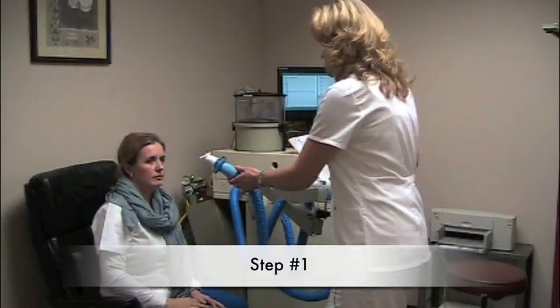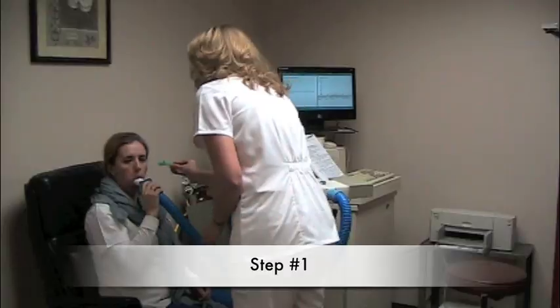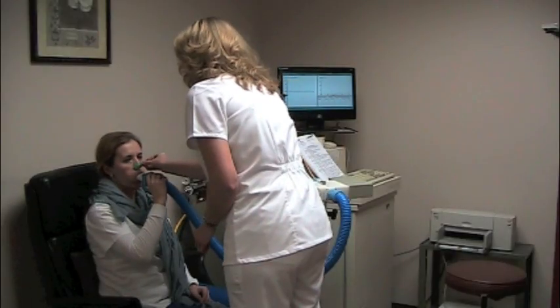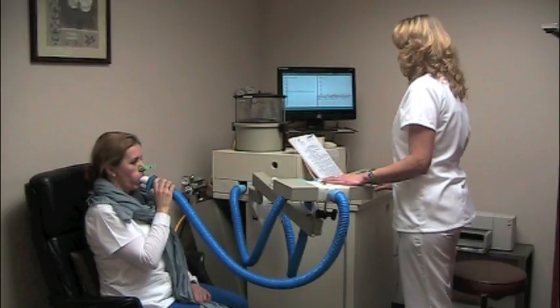The first step: the patient puts everything to your mouth, put the clip on your nose, and breathe normal. Breathe normal. In and out.